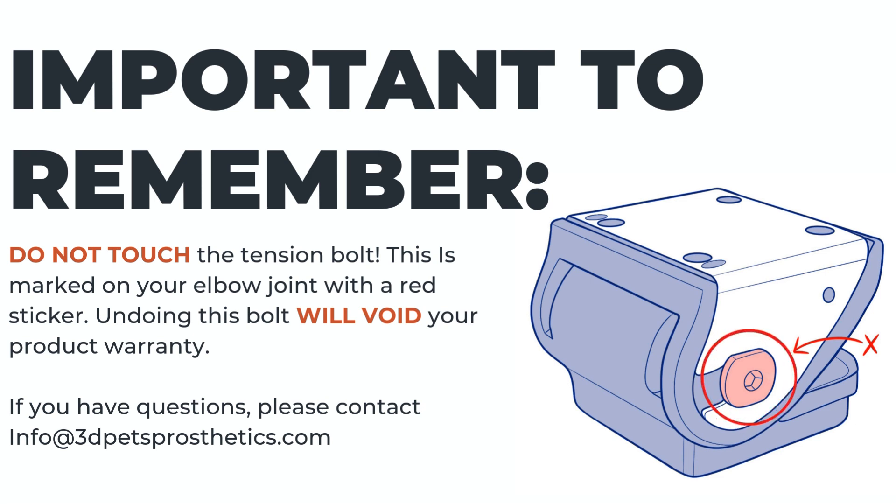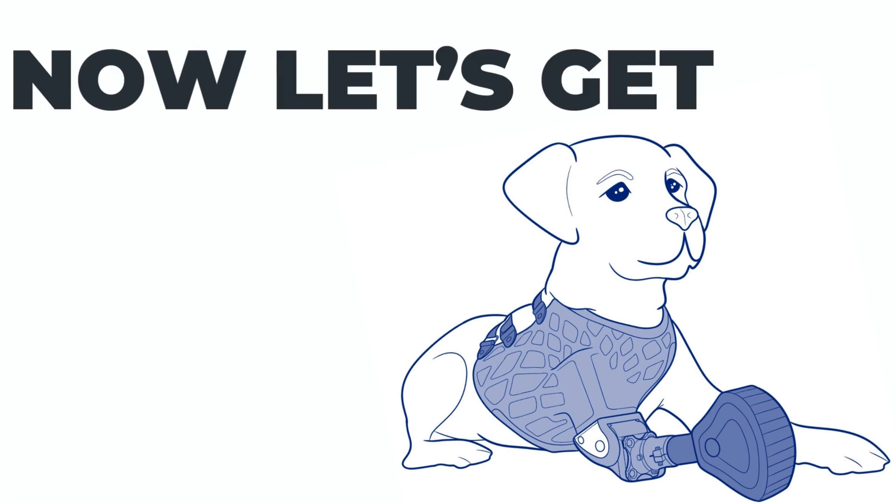Please remember not to touch the tension bolt. This is marked on your elbow joint with a red sticker. Undoing this bolt will void your product warranty and will render the product defective. Now let's get started.